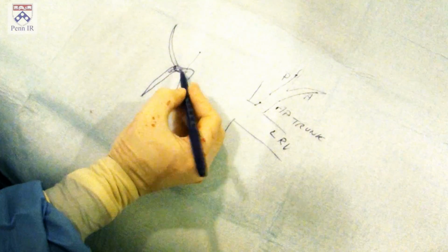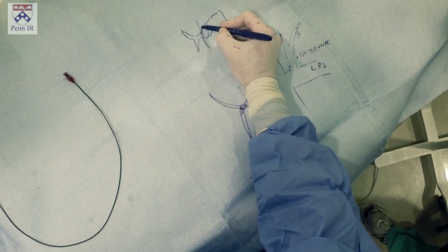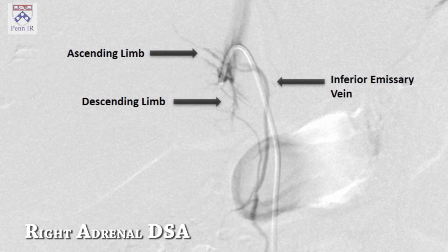The other theory about the hole is that your catheter is not quite in it, magnified here, but you've got stuff flowing up along the back wall that you'll aspirate some of into there. That was the original theory, but for me, that's not nearly as important as some of the other considerations, especially on that side.